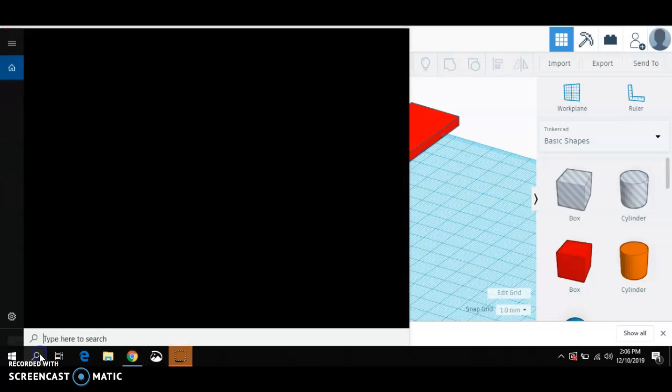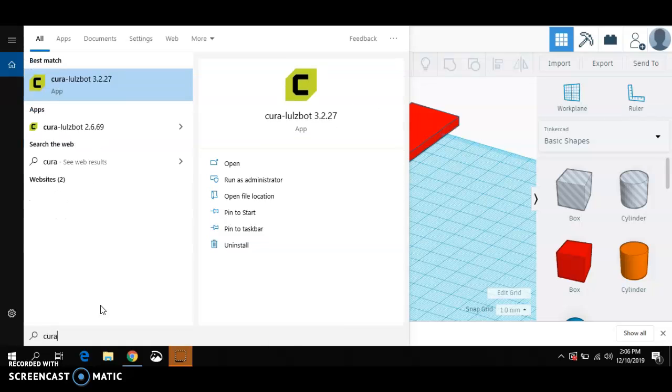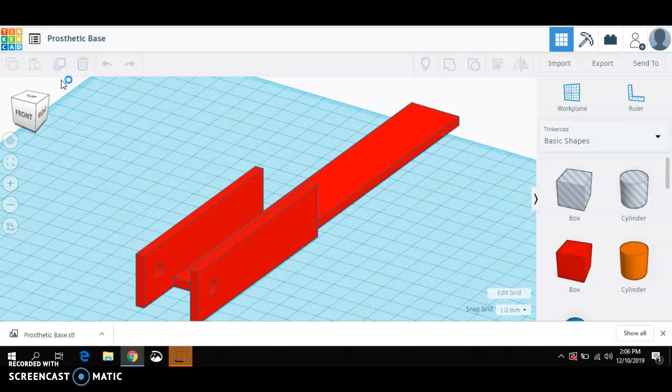Now, Chromebooks cannot run the slicer software Cura. I'm going to type Cura in here. So you're going to need to get your downloaded file to the slicer software. You can do that by opening Tinkercad on a classroom PC that has Cura, and then downloading to that PC to bring it into Cura. You can also download the Tinkercad STL file on your Chromebook and email it to yourself, and then pull up your email on the classroom PC and bring it into Cura.